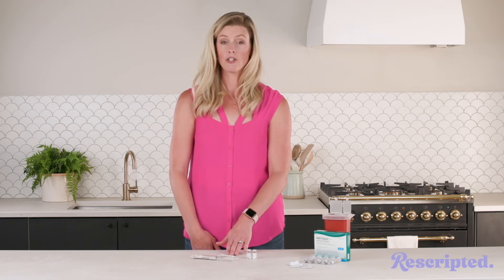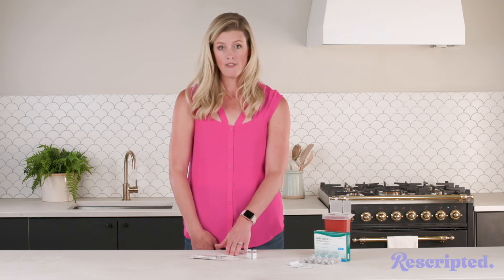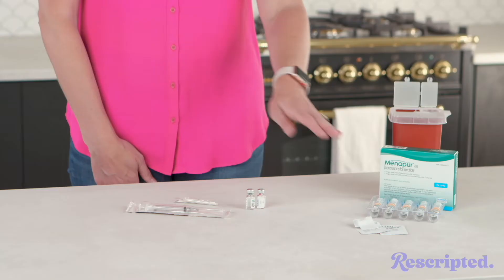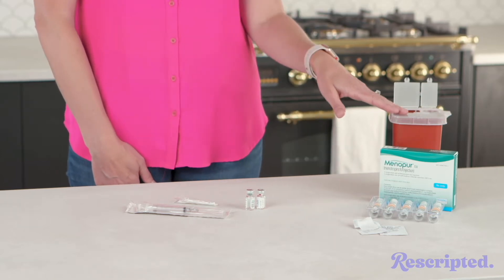You're going to have an injection needle, which is typically 27 gauge, half inch, but this can vary. You're going to need alcohol swabs and don't forget your sharps container.